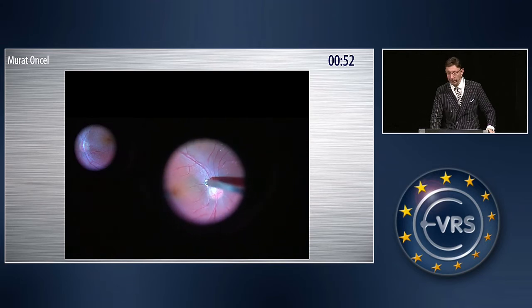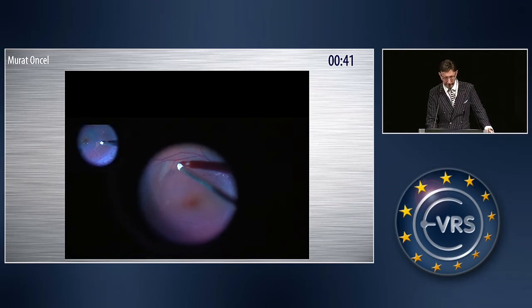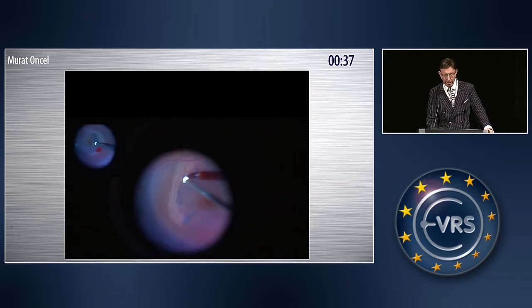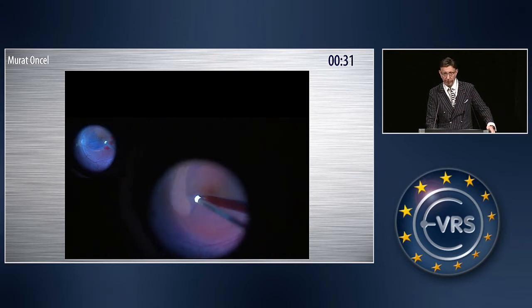Here is the video of the patient. The left corner is the left eye; this is the right eye. We are using Brilliant Blue stained ILM peeling. I did the whole peeling with the Tano Diamond Dusted Scraper. You should always touch the ILM, not the retina — you can harm the nerve fiber layers with the diamond dusted tip. This is a little bit fast forward.